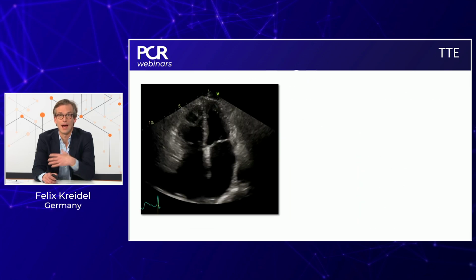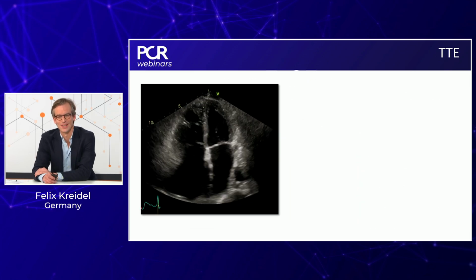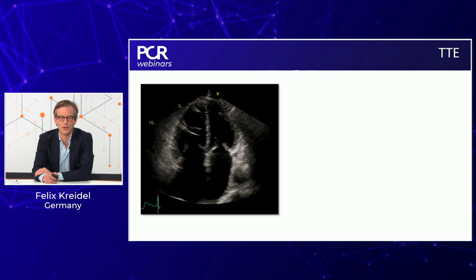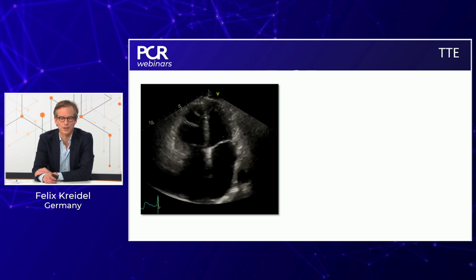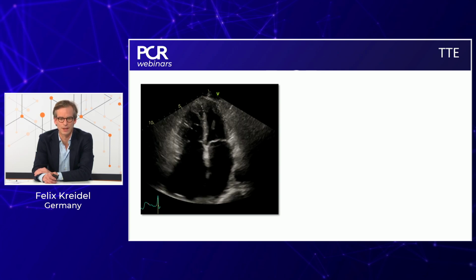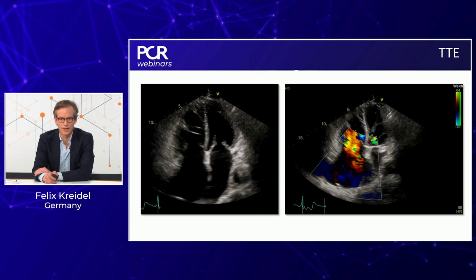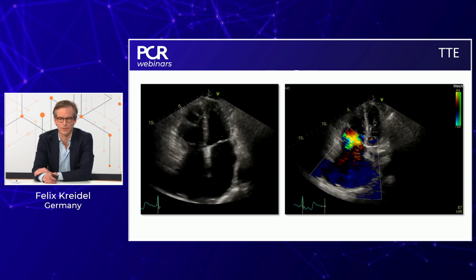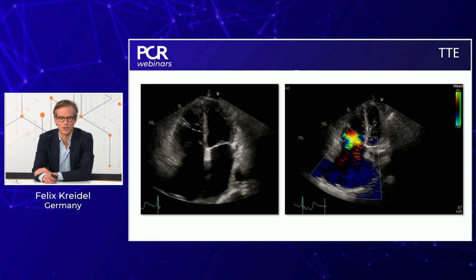And our absolute mainstay in further diagnostics, obviously, is echocardiography. I'm here showing you the TTE of this patient, the four-chamber view, and you can directly appreciate very dilated atria and a very dilated RV. And color Doppler information is also very positive for severe tricuspid regurgitation.